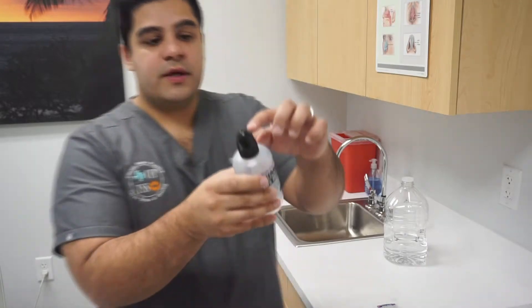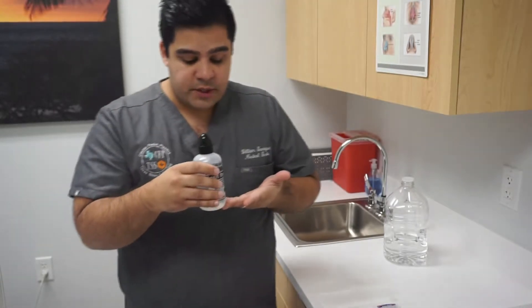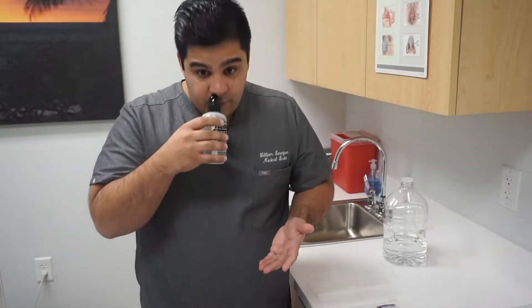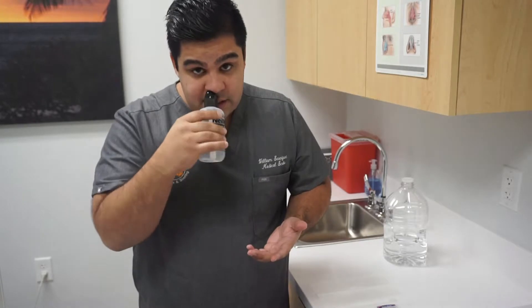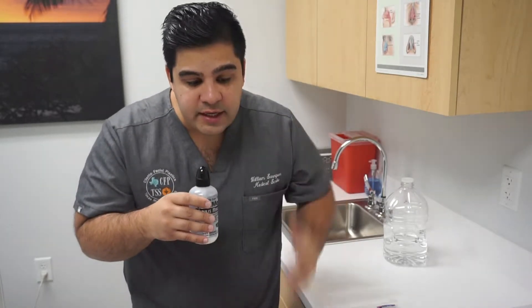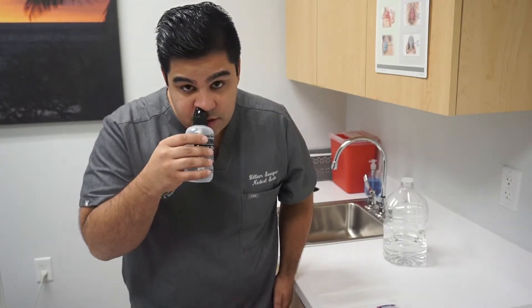You want to make sure that the hole right here in the bottle goes straight up your nose. You want to make sure that the bottle always stays perpendicular to the ground. Whenever you lean forward over the sink, you never want to tilt the bottle in any certain way — always keep it perpendicular, lean your head, keep it straight, and insert the hole into the nostril.